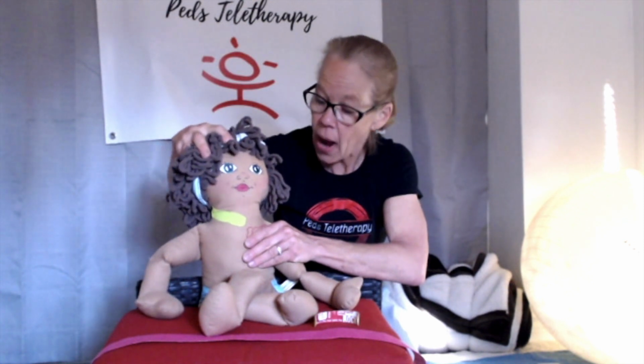The other thing is, depending, if it's mild, you tend to just see a little tilt. If it's more than mild, you might also notice she likes to look to the left side further and more often, and might have some difficulty turning to the right. So if you see a child who's bent a little bit to the right and maybe has a preference for turning left, that is a right torticollis. So I already have a test strip on her, but I'll teach you how to do this.